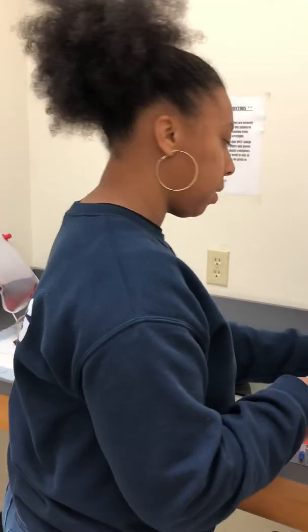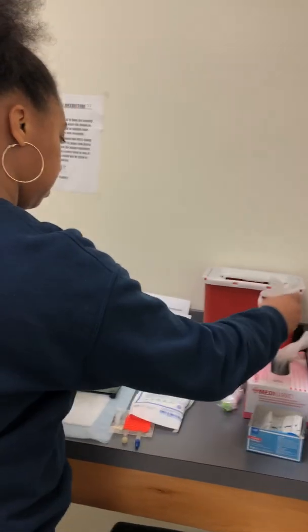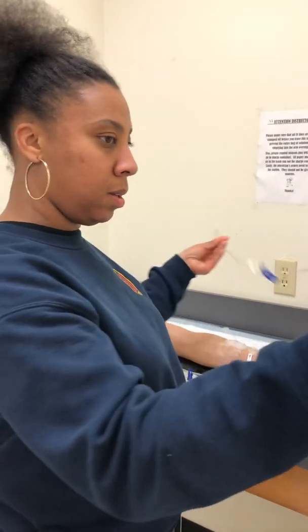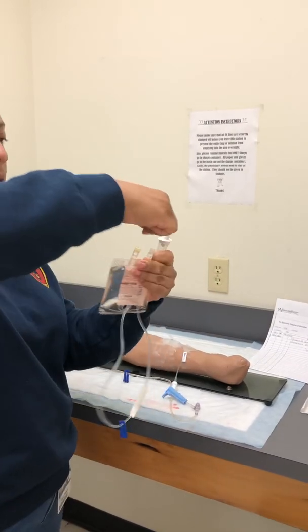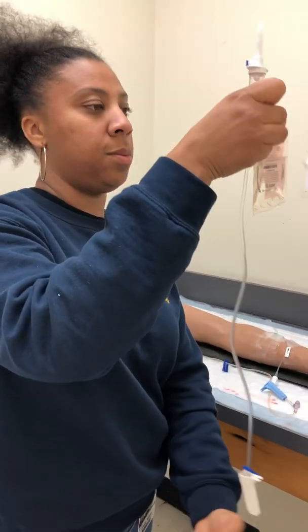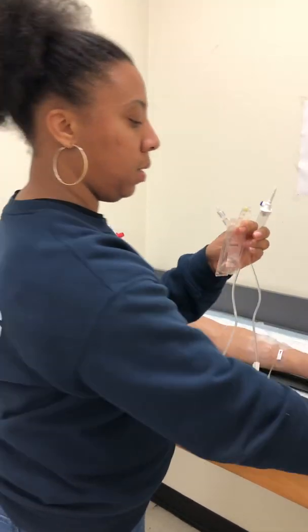Okay, I'll go ahead and put my gloves on. Well, I tell you what, before I put my gloves on, I will go ahead and get my IV stuff set up. So I'll open it up. All right. Get my tubing together. Here's my medication. I would go ahead and take this off without touching. Oh my gosh, that was not supposed to happen. Okay. Take the lid off, and I will insert it.